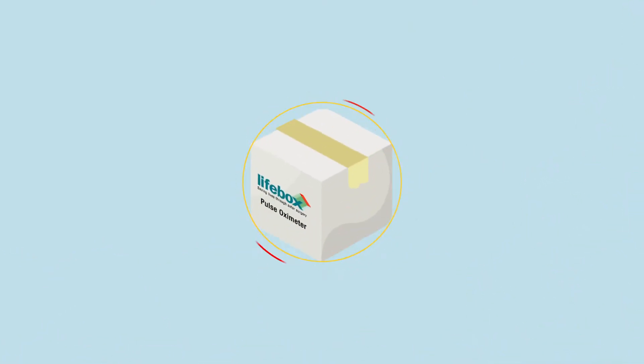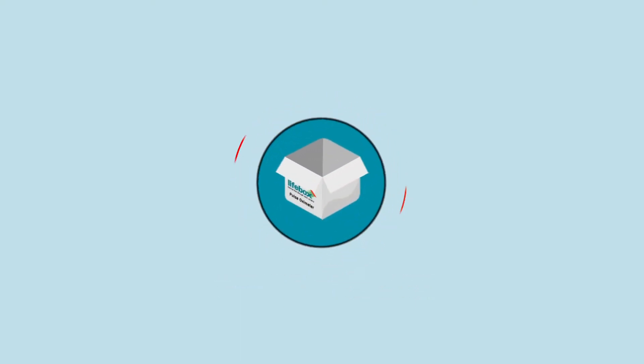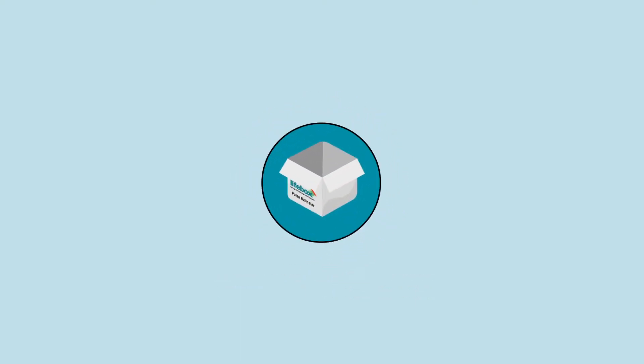So now we know what the oximeter does, let's take a look at what is included in the Lifebox. The oximeter is carefully packed for safe travel. Open the box and take out all of the pieces.